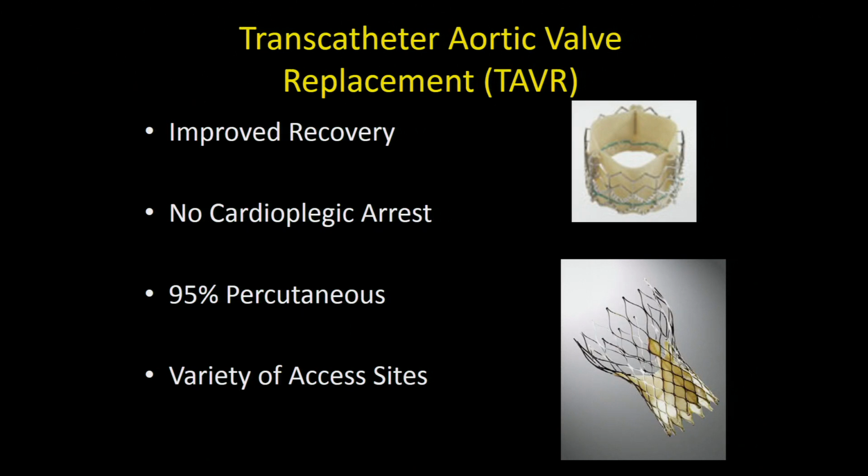We also don't require the cardiac bypass machine, which can be pretty tough on some of our elderly patients. The vast majority of the time, we can do this completely percutaneously. Over 95% of our patients, and this is true for UT Southwestern specifically too, have this performed just through a transfemoral access.